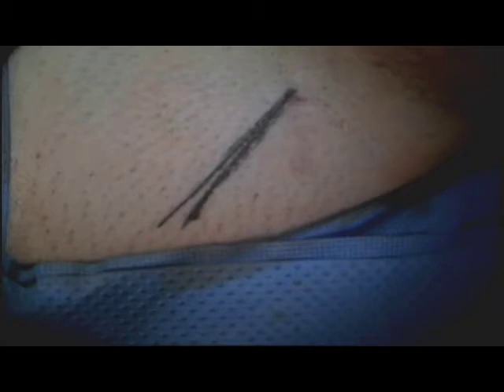As you can see, the patient has had prior right groin surgery. This consisted of a subinguinal varicocelectomy. We have therefore marked out an area above this to give access to the inguinal canal should this be required.